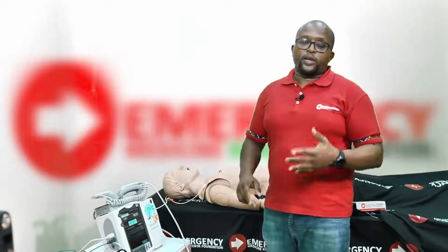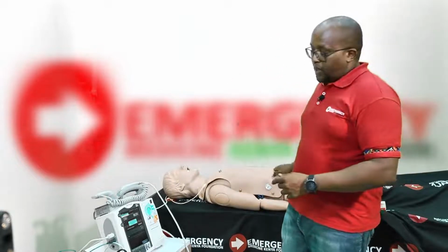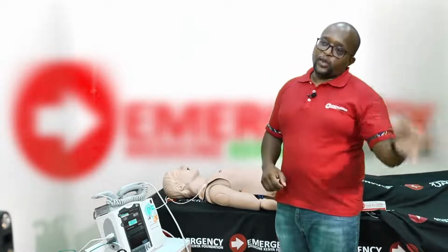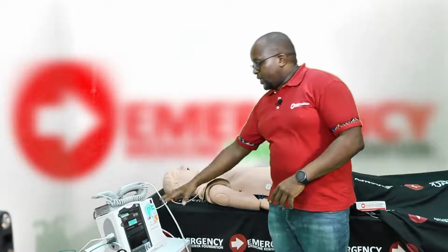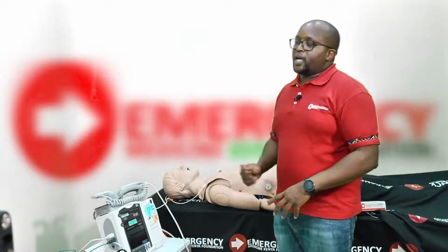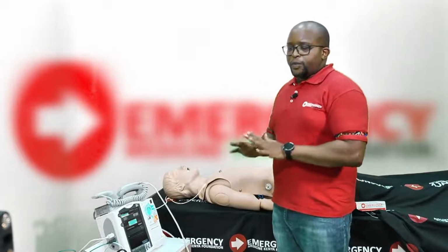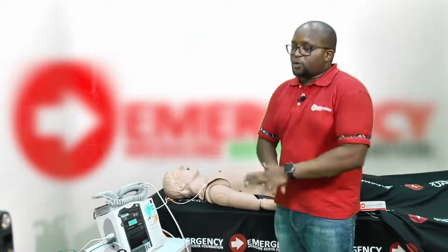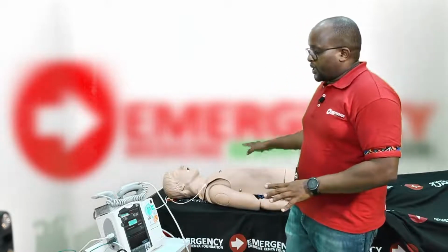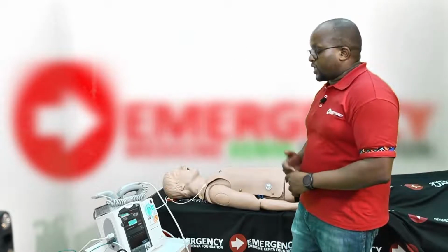If it's a shockable rhythm, whether it's ventricular fibrillation or ventricular tachycardia without a pulse, then resume CPR, charge the defibrillator, 360 for monophasic, recommended 150 or 200 for the biphasic, or what's recommended, and then once you're ready, momentarily pause CPR and shock the patient. This should be less than 10 seconds. Shock the patient and then resume CPR until the next rhythm check in 2 minutes.